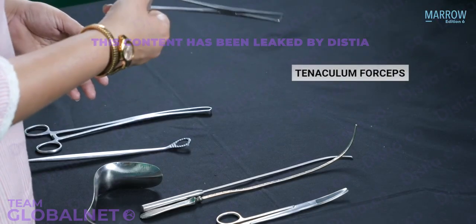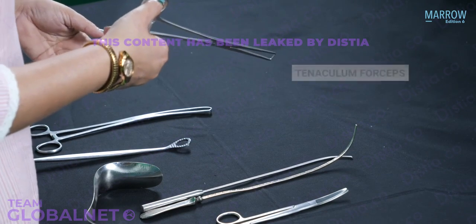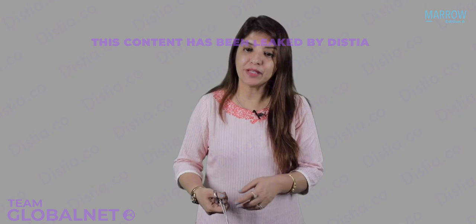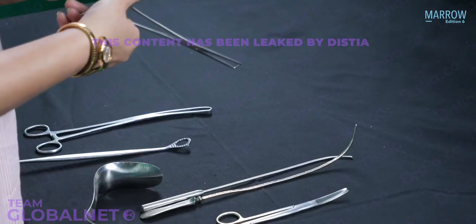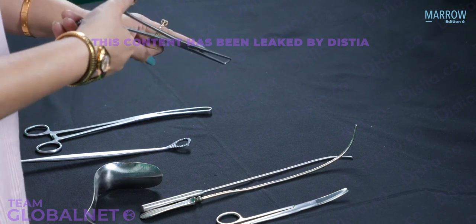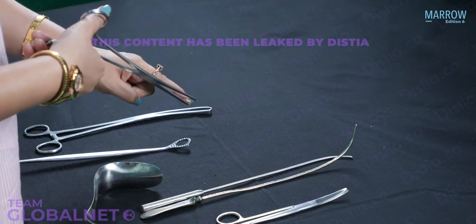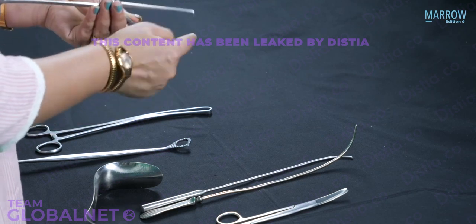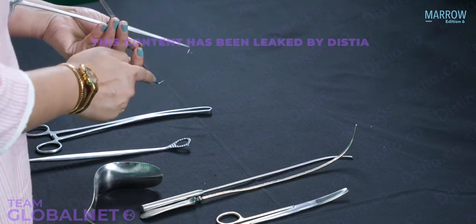So you can also use a tenaculum to hold the anterior lip of the cervix. Now if you look at the tenaculum, a tenaculum also has a ratchet lock at the posterior end, and anteriorly between the blades you are getting space. Now when you open the tenaculum, it is single toothed. Can you all see the single tooth over here? Yes.